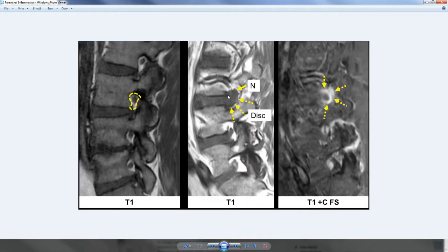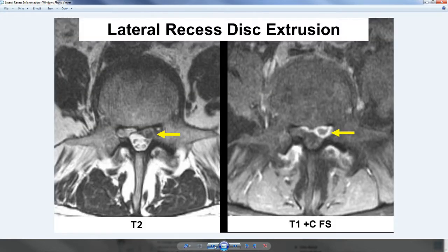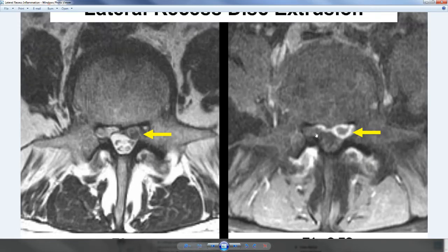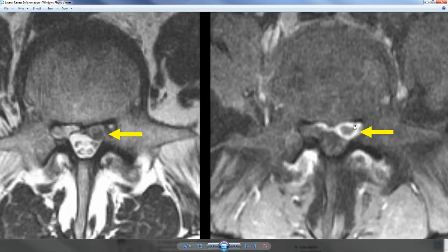Most of what's causing this compression and signal change on the MRI scan is all the surrounding white inflammatory fluid. This occurs also in the foramen. A T1 image here shows what looks to be a huge foraminal disc herniation, but when you add contrast, the majority of that is actually inflammation surrounding the nerve root — the little dot right here in the center on a parasagittal view. Here, in a situation analogous to today's case, there's a lateral recess disc extrusion displacing the nerve root, with that central fragment surrounded again by bright white inflammatory fluid. That's the reason why I choose to do a minimal discectomy.